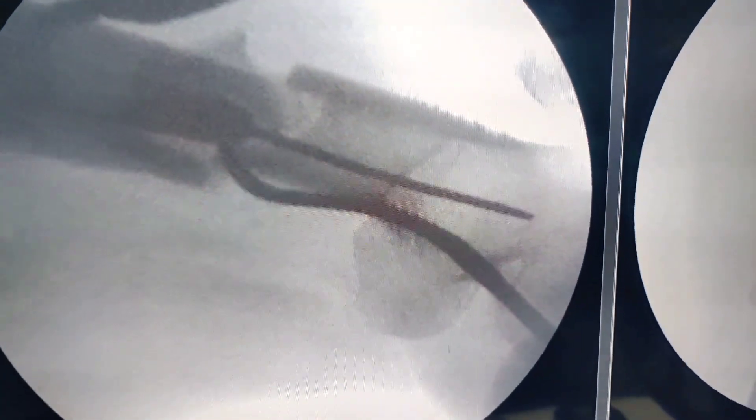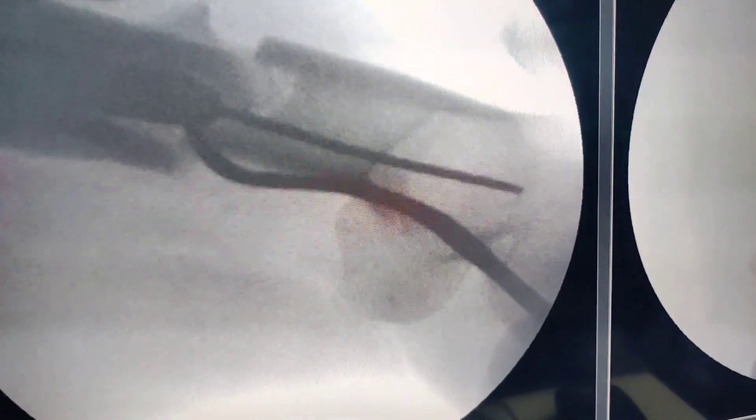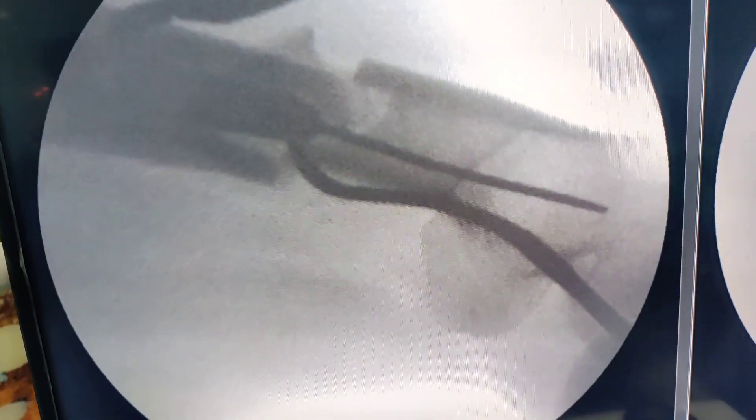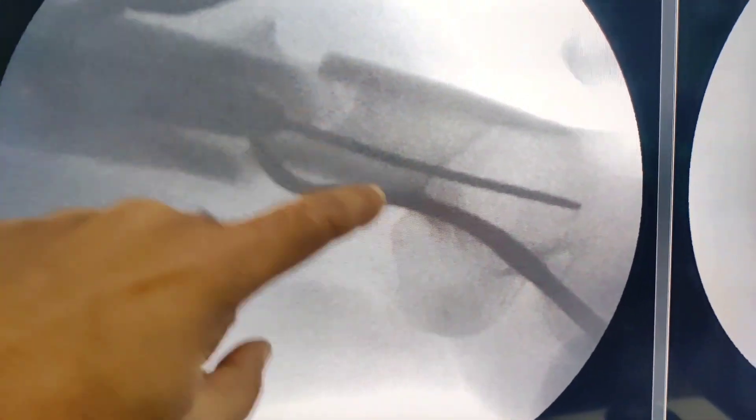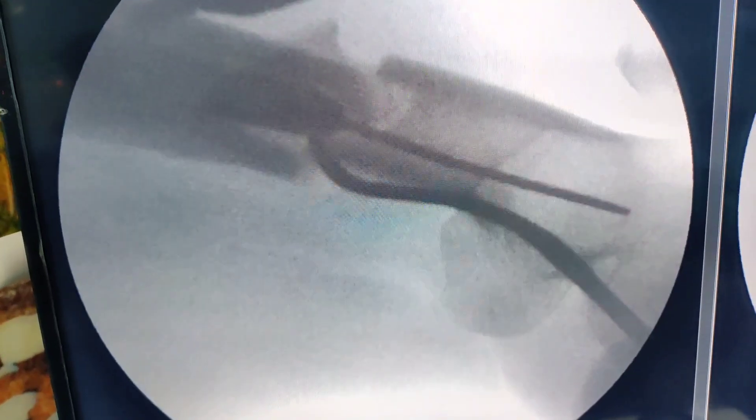On this occasion we managed to get a good position and they were able to get the guide wire, but you can do it from the very beginning when you are struggling to pass the guide wire. Make two small stab holes, use Hohmanns, and you will be able to pass the guide wire in a far more acceptable position. There is no harm — you are not actually opening it, you are just making two stab holes, and it is as good as doing it closed.